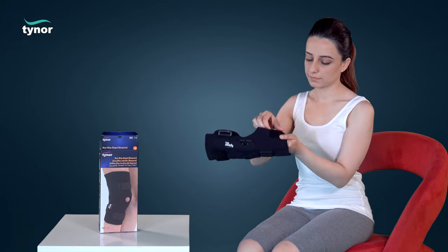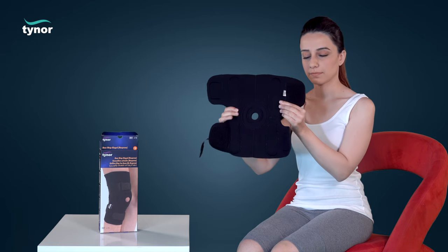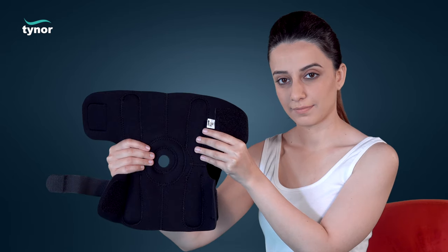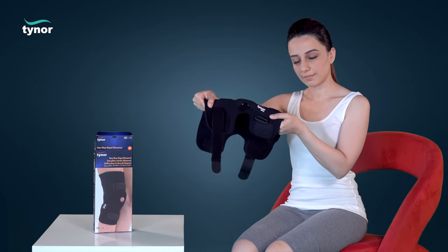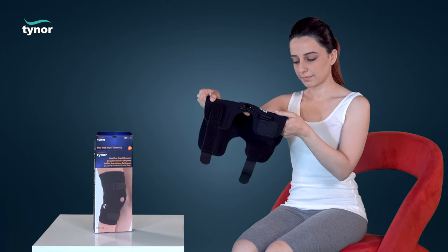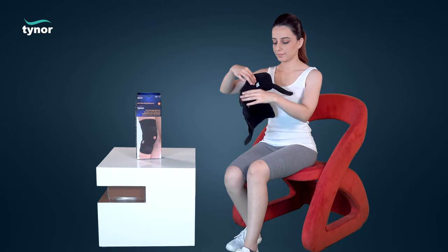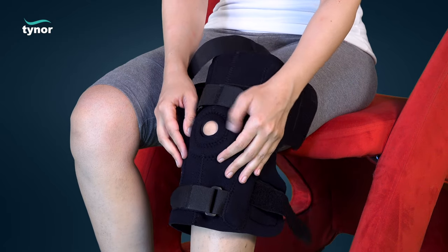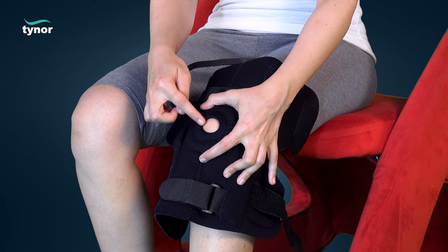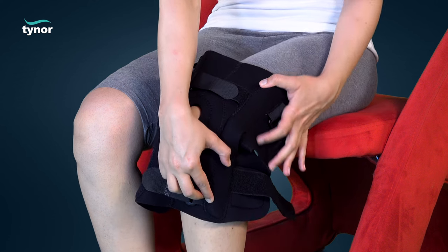Unfasten the hook loop fasteners. See the inside label for correct position of the product. Care should be taken to match the flexion movement of the hinge with the natural flexion movement of the knee joint. Placing broadside up, the product is placed on the knee with the patellar opening matching with the position of the patella.